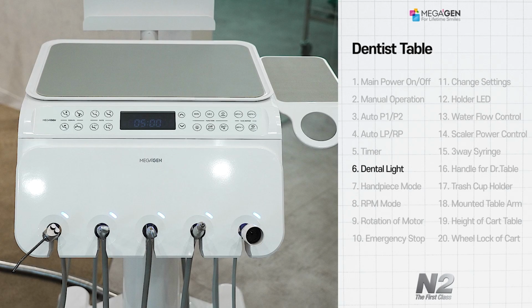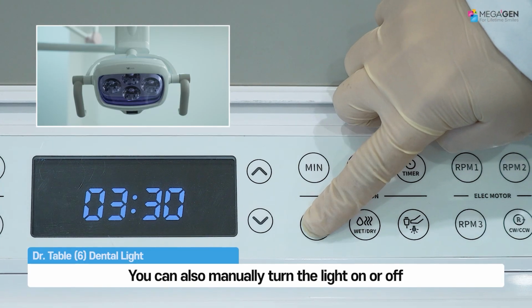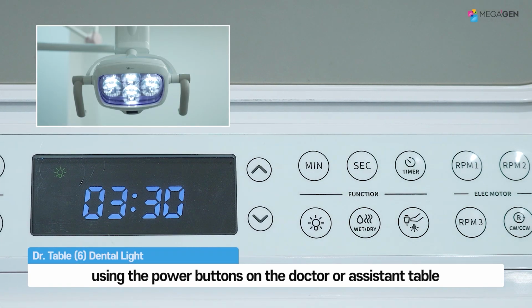Light main power. You can also manually turn the light on or off using the power buttons on the doctor or assistant table.